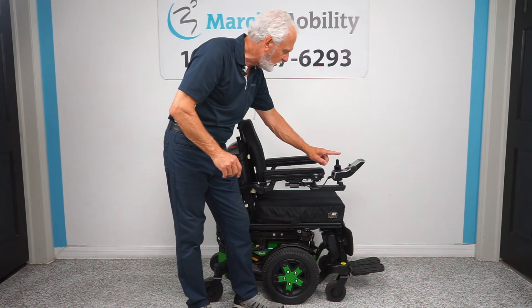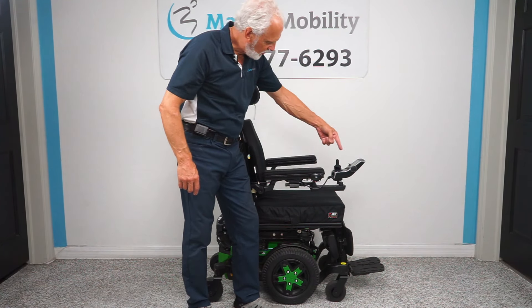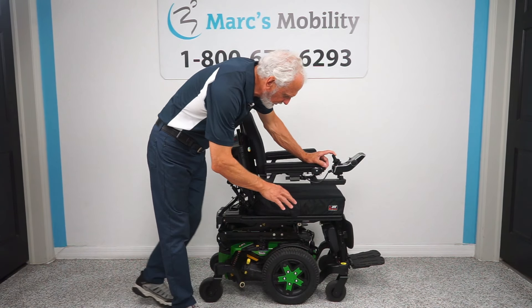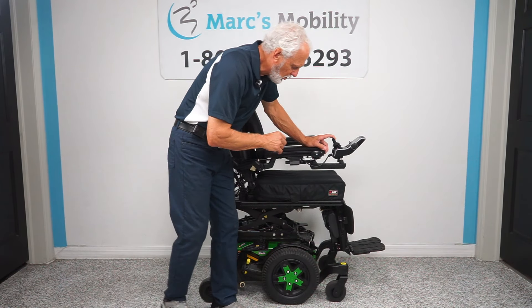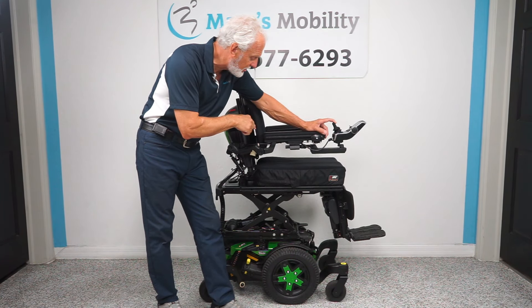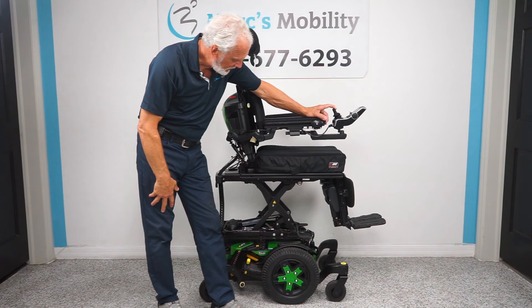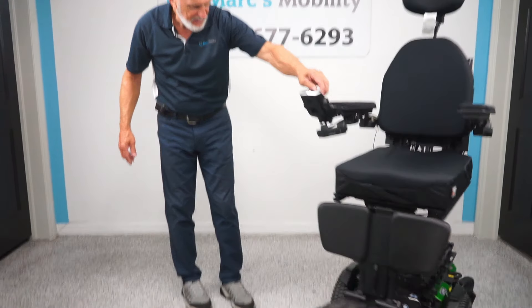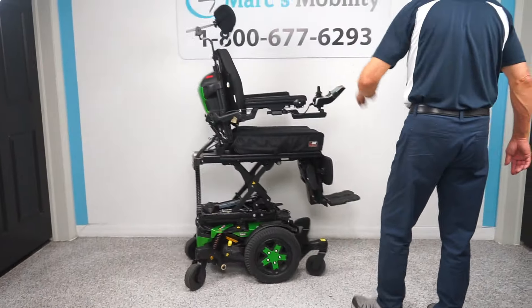If you move the joystick sideways the color will change. Now I see just the bottom cushion is yellow. If I pull it back you'll see the seat start to go up. When you start, the seat will be roughly at 22 inches. When you go all the way up you'll be at 34 inches — you will be eye level with someone. When you're driving this chair you can be talking with someone at the same eye level, and you can still drive the chair at a good speed.